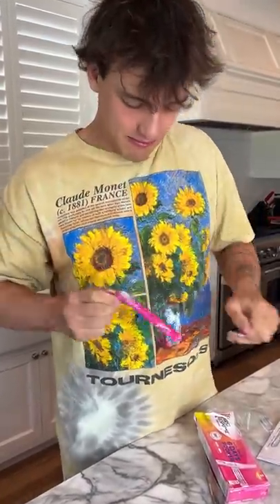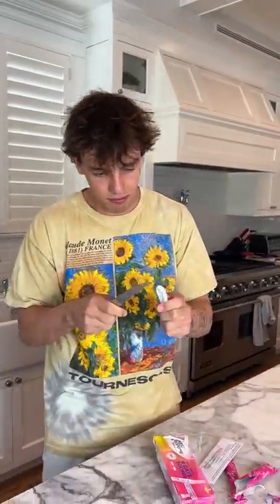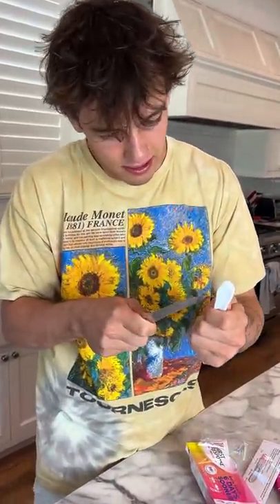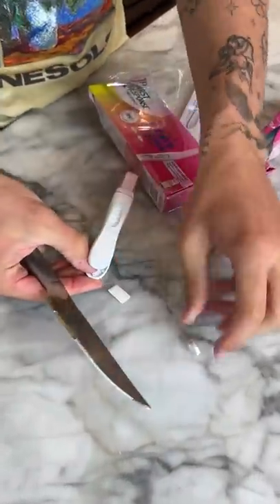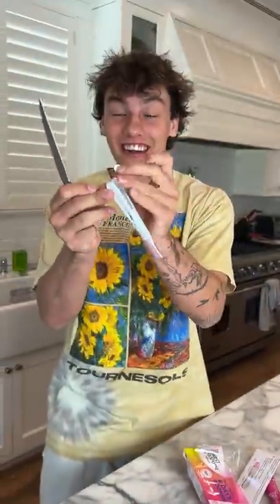Alright, opening up the packaging — perfect. Taking it out, here it is. Now we need to pry this open, and there should be a Plan B. Oh my gosh, it actually works — look at that!